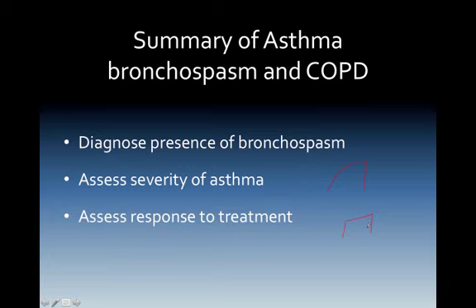Now, what we should see in asthmatic treatment is at first we may have very small, tiny shark fins, low amounts of CO2, and that's because they're under bronchospasm. They're still trapping air. We cannot see the full gas sample, but once we start opening them up, we will see an increased rise in gas sample, until we correct the respiratory acidosis that they're currently in.